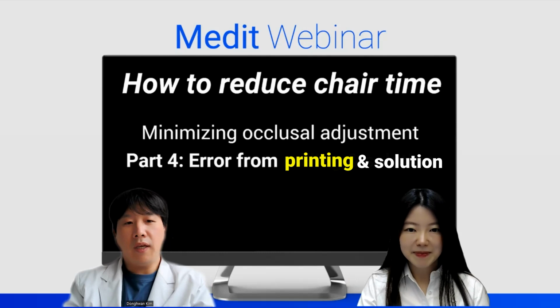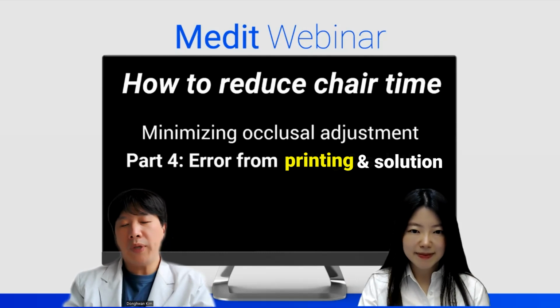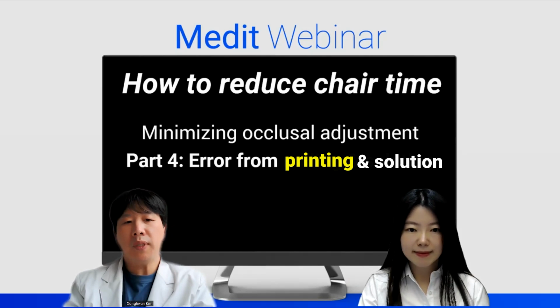Yes, I had prepared all about printing. It is going to be a powerful tool if you are able to deal with printing work in your daily practice. You will experience your treatment workflow become simple and easy. So I would like to emphasize how much profile validation is important and share my clinical tips to resolve dimensional inaccuracy in 3D printed crowns by improving profile validation.